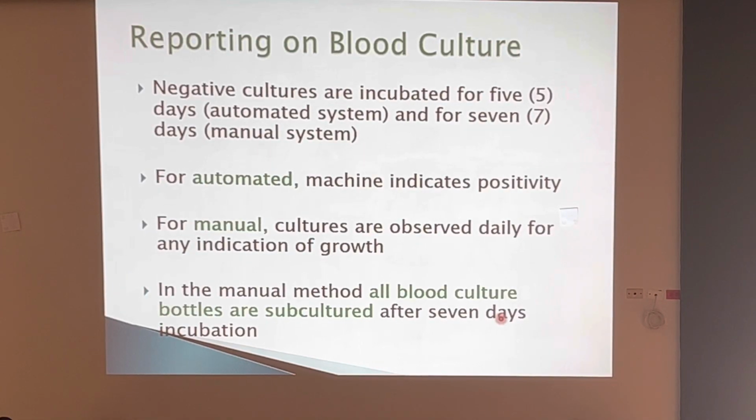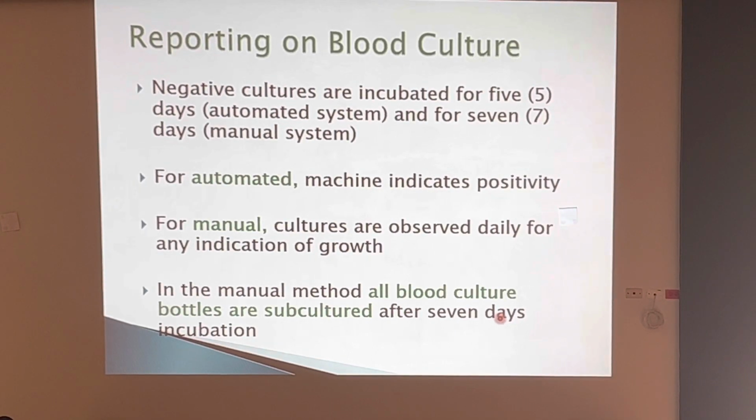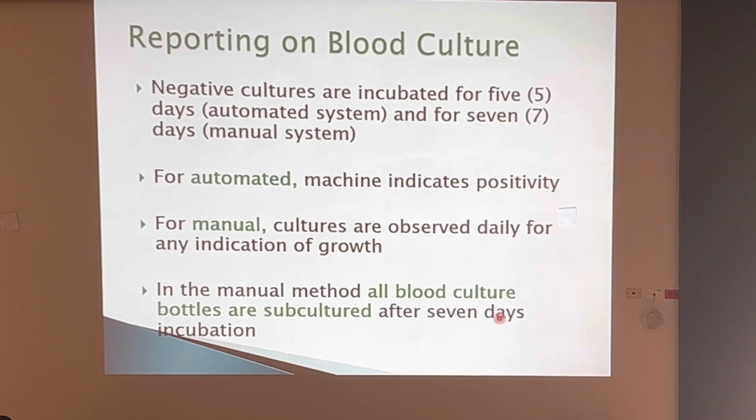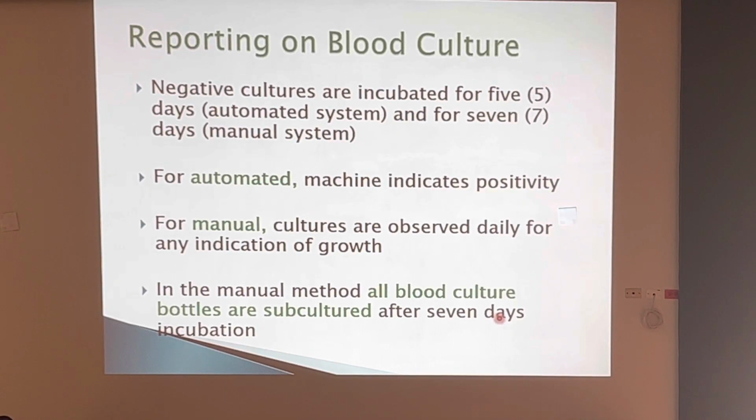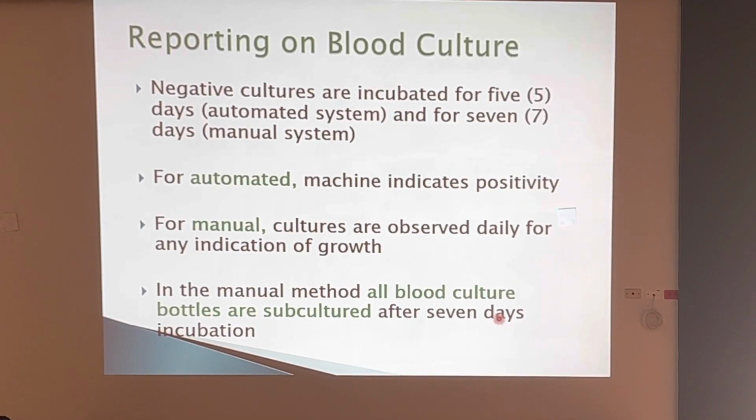Now, on your automated blood culture bottles, as the machine is shooting that laser through your bottles, day 1, day 2, day 3, and it's not detecting anything, that incubation continues up until day 5. After day 5, the Bacti-Alert, which is automated, which is also connected to the LIS system, the laboratory information system, sends a message over to your LIS. It's been 5 days of incubation, not detecting any growth.